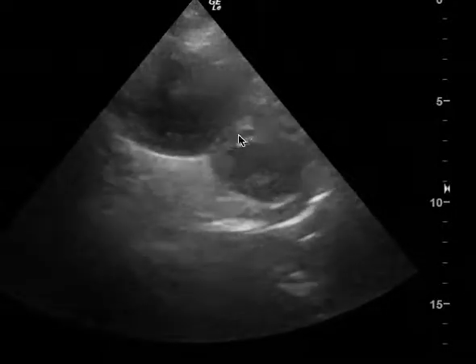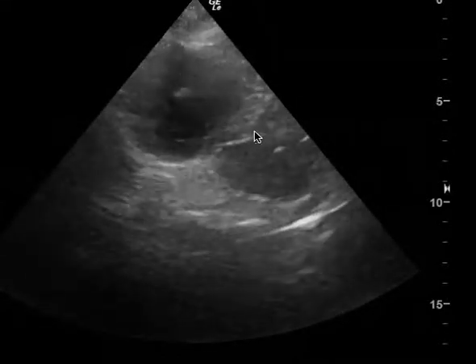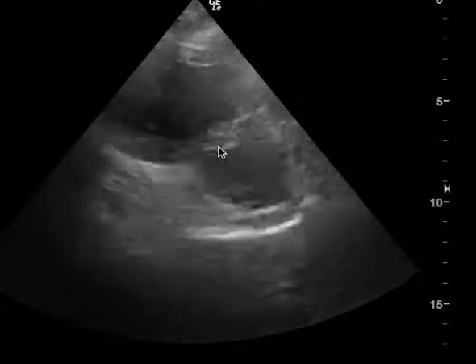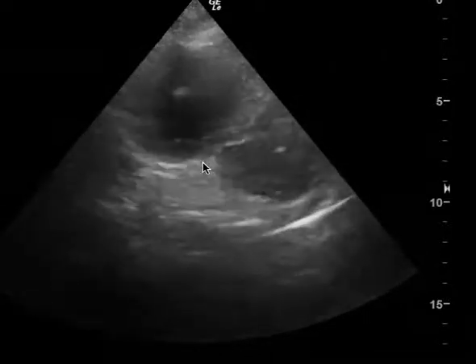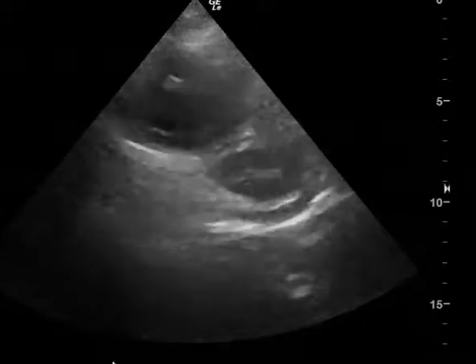In addition, you have what's called a D sign. This septum here, because of the pressures on the right, is being pushed inward towards the LV, which creates a flattened septum — also known as a D sign — where the left ventricle makes a D as opposed to a normal circle.